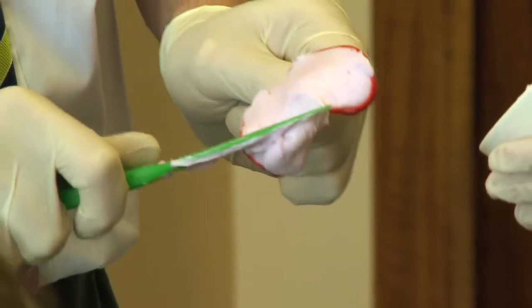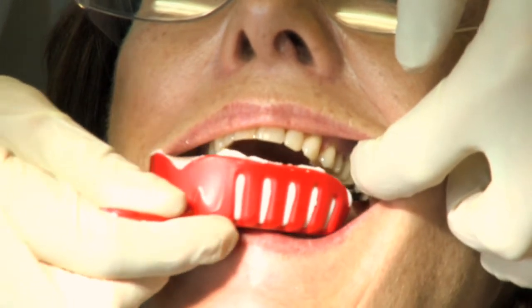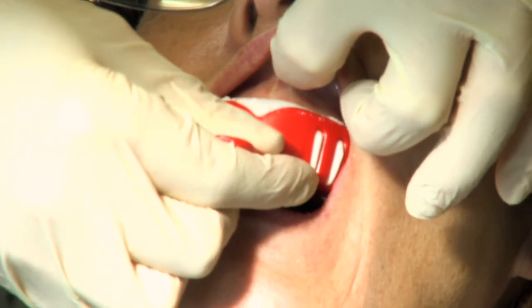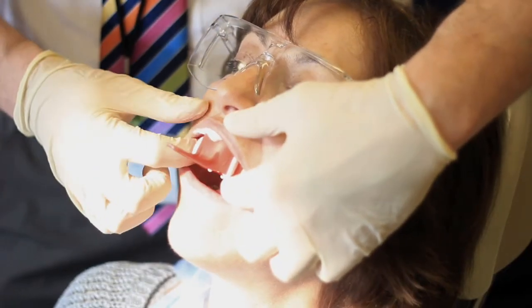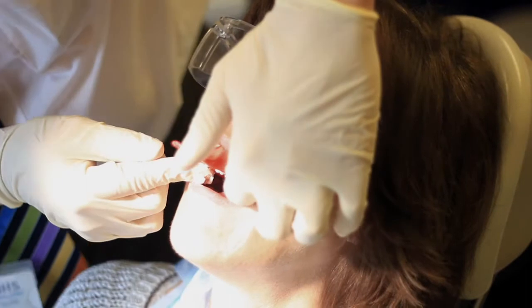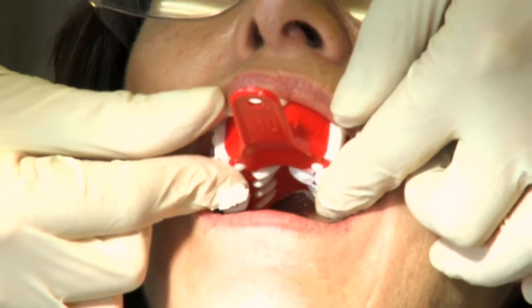And we're going to just take off the excess material so that it doesn't go down the patient's throat. And then we're going to put the top impression in now, just like we did before when we tried the impression tray. So we're going to stretch your cheek out and actually rotate the impression into the patient's mouth. And holding the lips and cheeks away, just gently press the impression into place. What we'll do, we'll just gently stretch the lip back over so that we get a nice detail of the soft tissues, and then just look down the patient's throat to check we don't have too much material, and that looks fine. So this should take about 2 minutes to set once again.